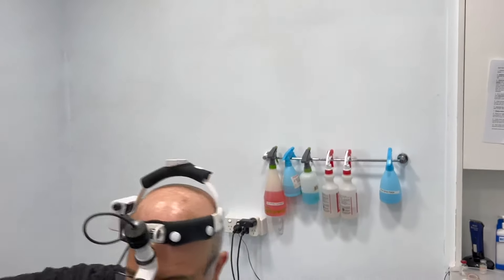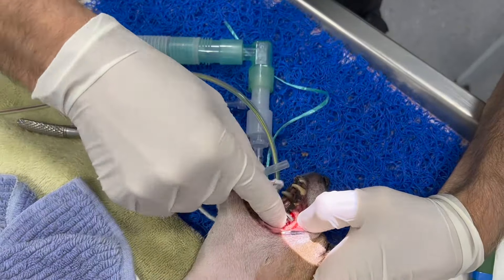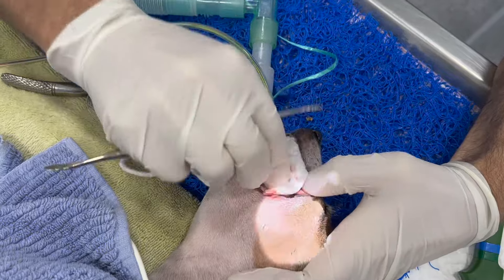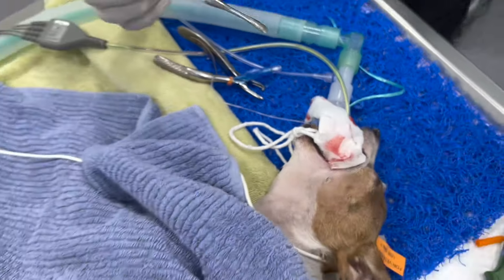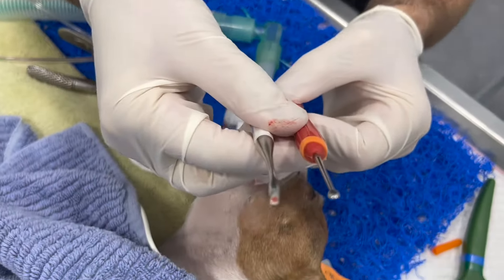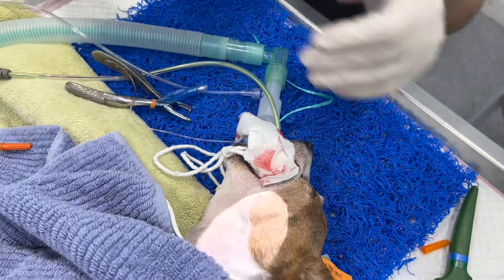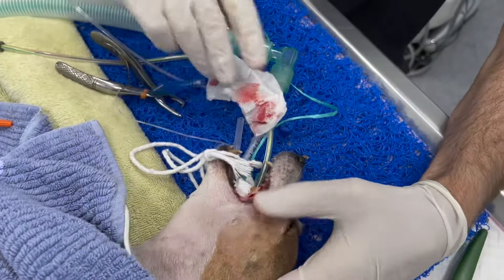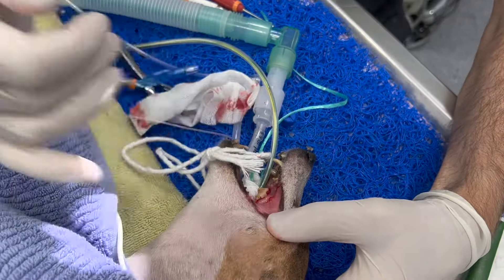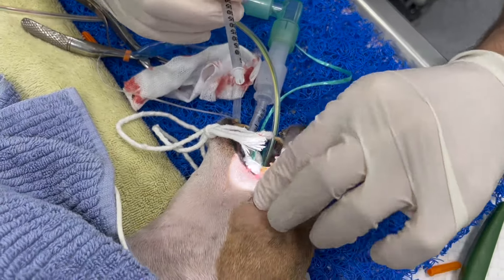This is called a periosteal elevator. We have various sizes — I'll start with a small one and go to a bigger one. I'm just elevating the periosteum above the tooth so I can cut the tooth into pieces, separating the periosteum from the tooth. The dog doesn't feel this because I'm using local anesthetic as well.